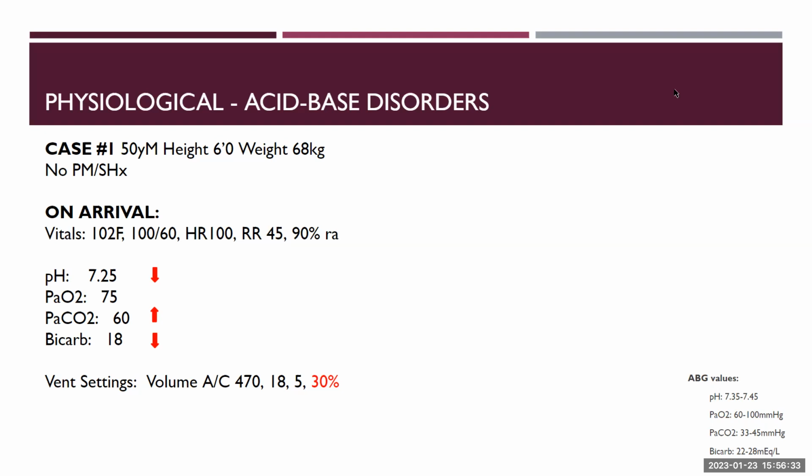And then just so you guys have this, so it's not something you have to remember, the ABG values are right over here in the corner. He looks septic and like he's retaining CO2, in a respiratory acidosis. Perfect. So he's breathing really quickly, but that CO2 is going up.